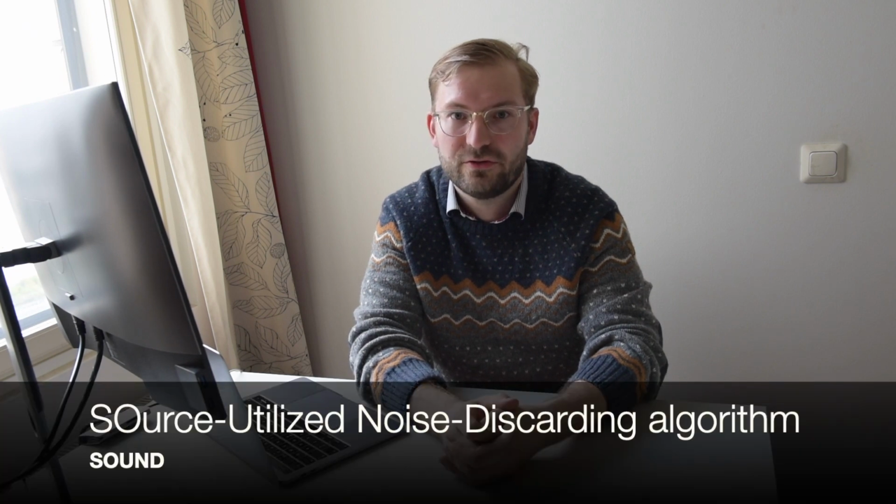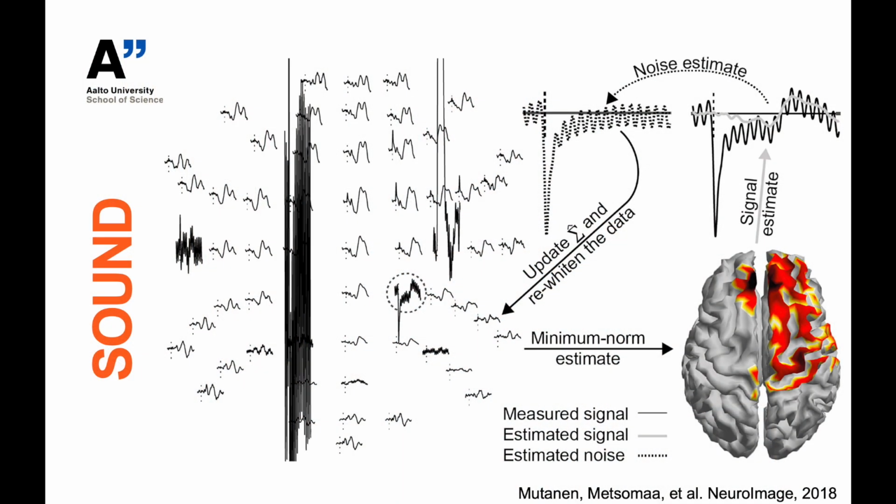The second method that we are going to go through today is called the source-utilized noise discarding algorithm, that we abbreviate SOUND. The SOUND is based on very similar ideas as the SSP-SIR and the similar theoretical concepts that I very quickly went through in the beginning of this presentation. The overall idea of SOUND is presented on this slide.